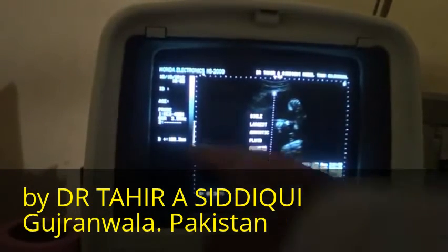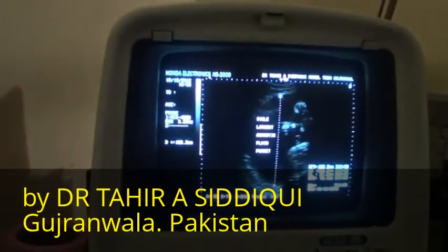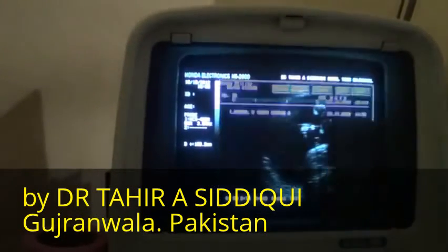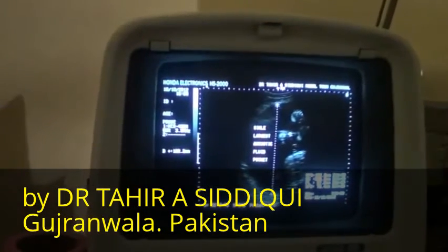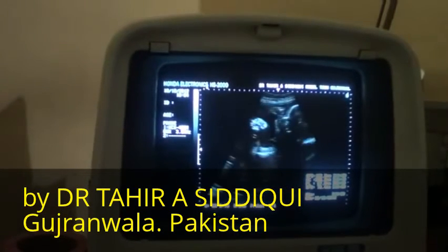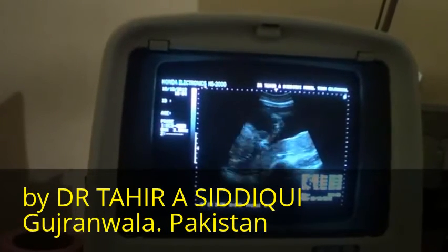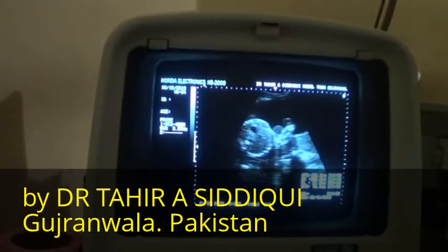And you see it measures 18.8 centimeters and is fulfilling the criteria of polyhydramnios. So first finding we have seen is that the placenta is posterior wall and marginal. Second, we have seen that the patient has hydramnios, polyhydramnios.